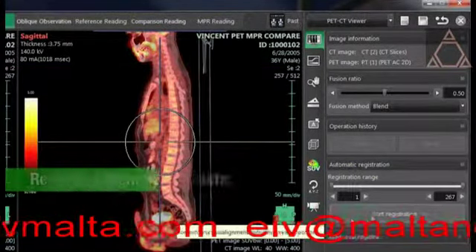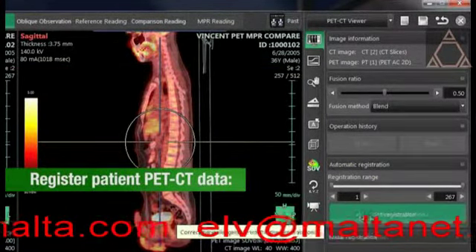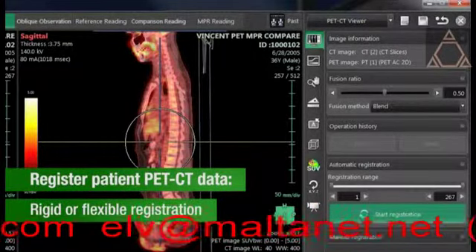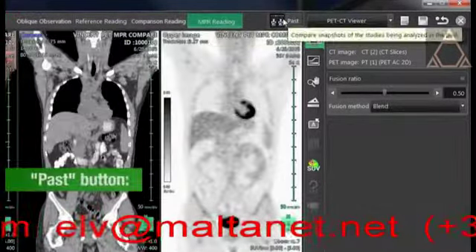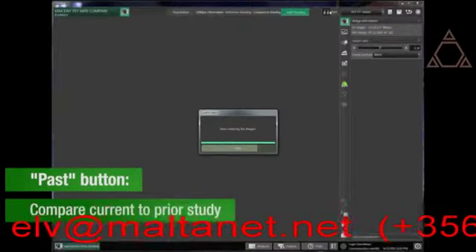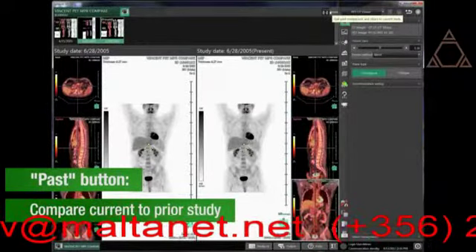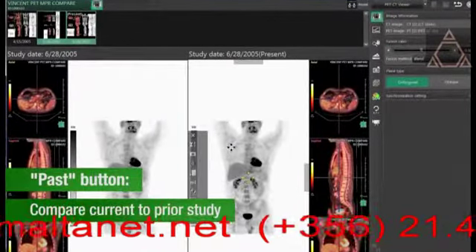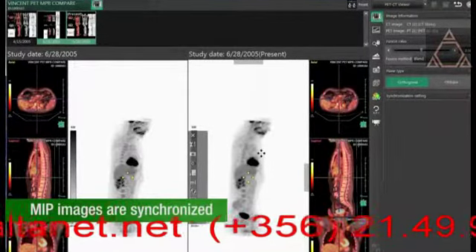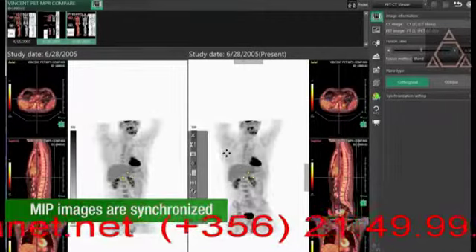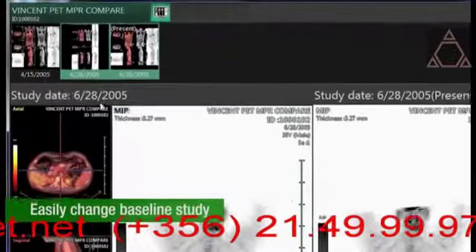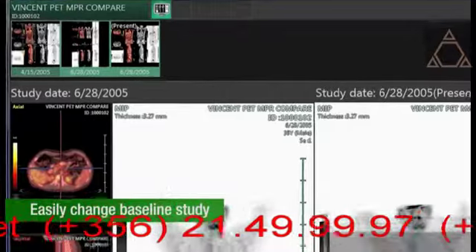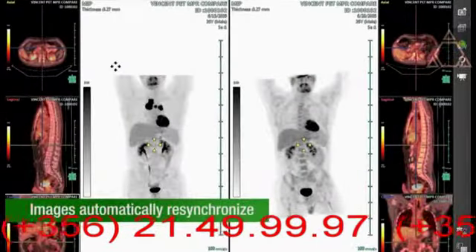The powerful PET-CT tool allows for rigid or flexible registration of PET-CT data. The Passed button allows two studies to be synchronized and compared with a click of a button. The images are easily registered and are then automatically synchronized. To change the baseline study, simply drag and drop images from the other study into the viewer for automatic resynchronization.